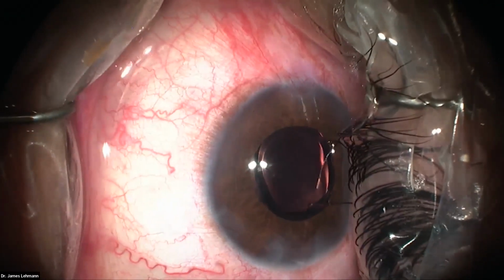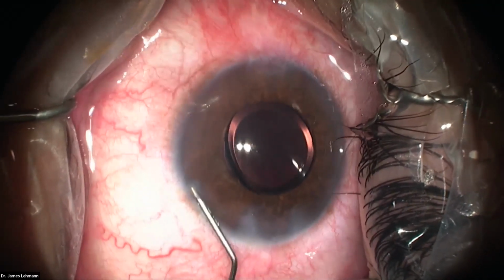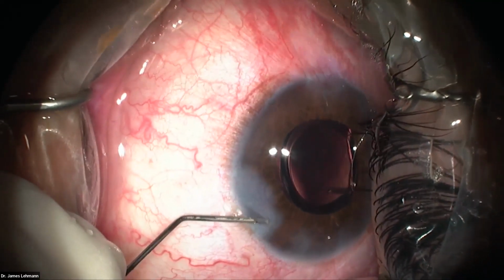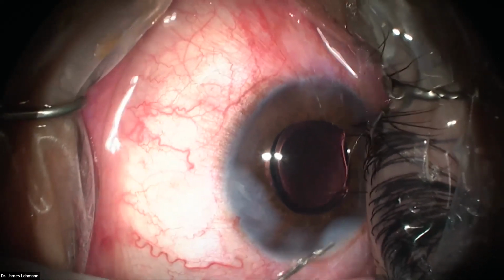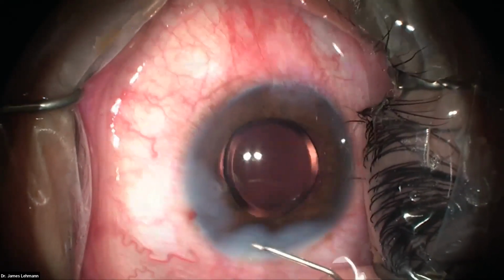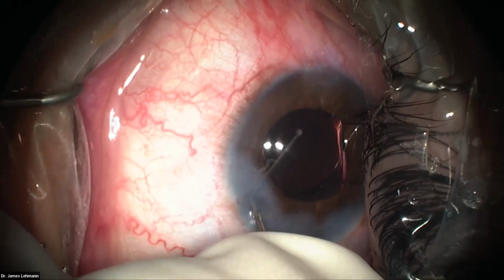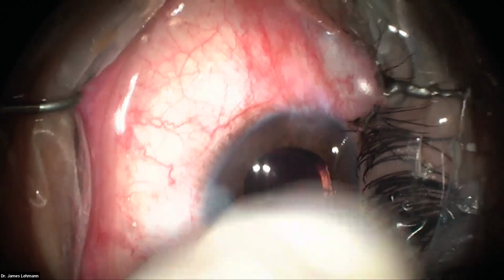Dr. Lehmann, why are you removing the OVD from the anterior chamber at the end of the case? And could you talk again about those little chips or those little fragments and why you search for those so carefully? Right. So you've got to be diligent about removing the OVD because otherwise they have pretty high pressure. It takes a while to clear the OVD from the anterior chamber. And those little pieces, they'll cause persistent inflammation or corneal edema. And so in eyes with pretty dense arcus, they can hide in sneaky places, mostly inferiorly.